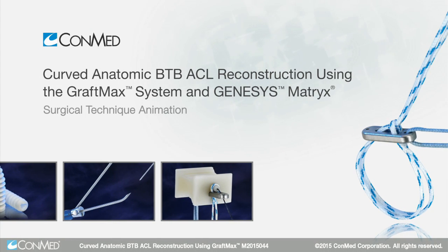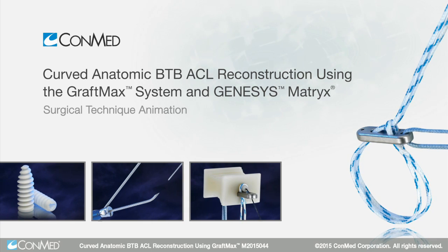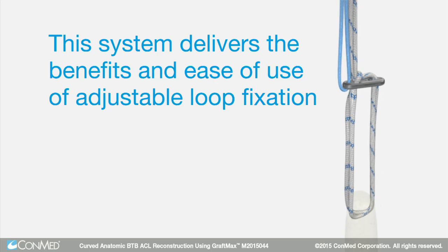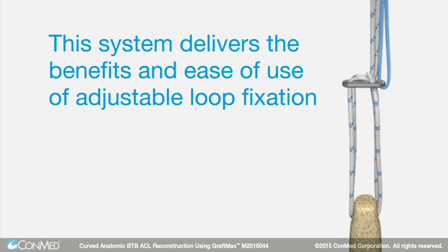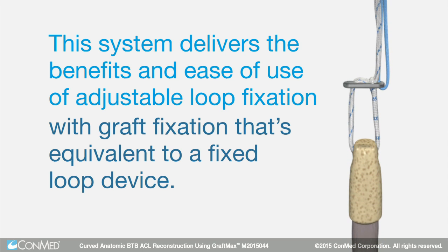The GraftMax button and curved reaming system provides precise anatomic tunnels without the need for hyperflexing. This system delivers the benefits and ease of use of adjustable loop fixation with graft fixation that's equivalent to a fixed loop device.